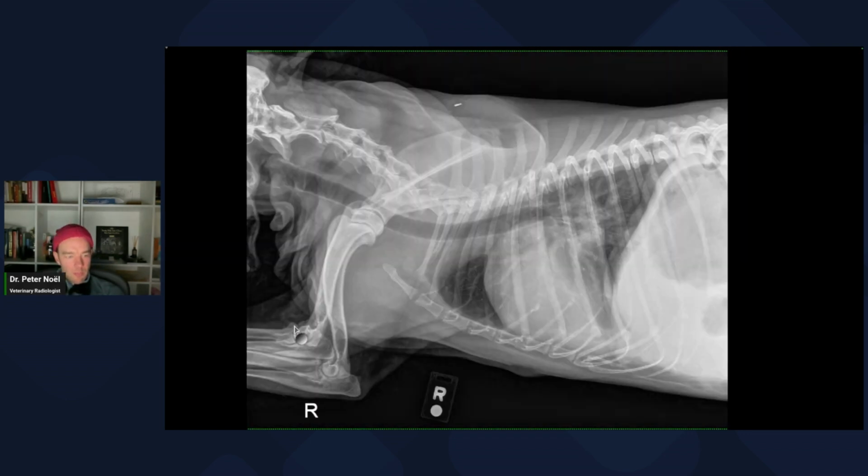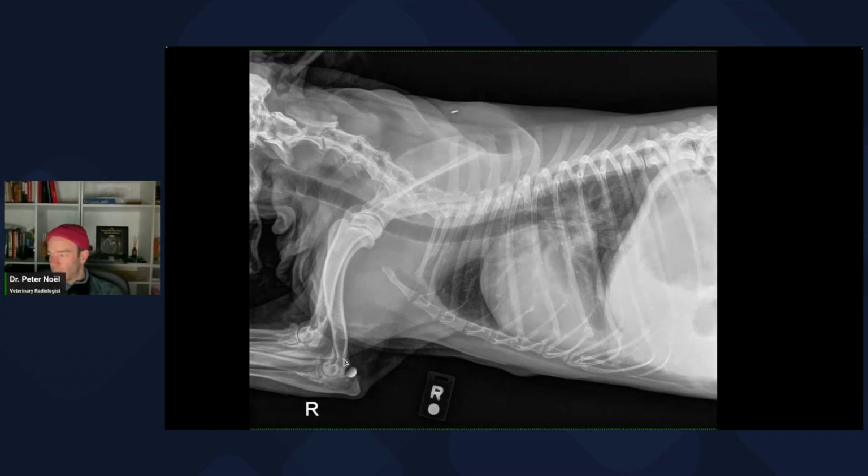His elbows look maybe like they've got a little bit of OA. Okay, I think we're done.